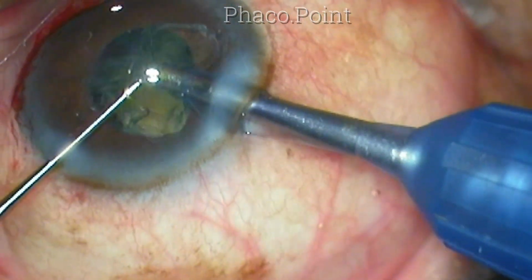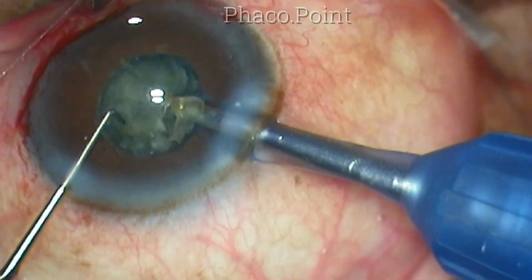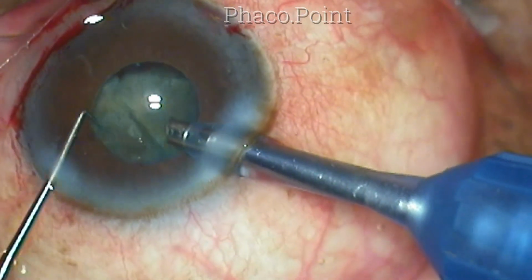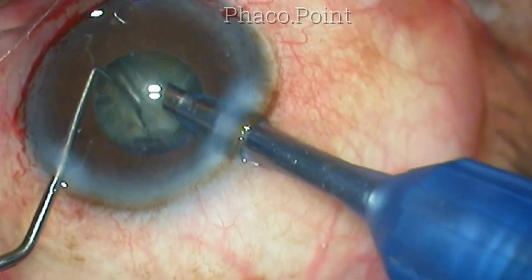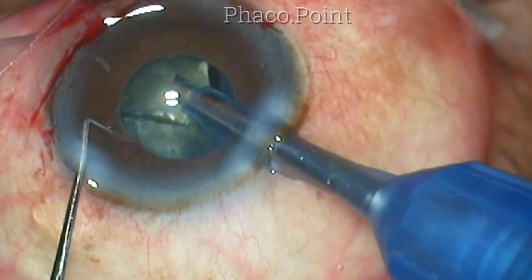There is actually no risk in performing the direct phaco chop, as you can see that every step that I am performing is totally under my control. I am not taking any additional risks. Even though the pupil is small and I have not used pupil dilating devices, I am staying quite in the central area and I am evacuating the pieces with considerable ease.